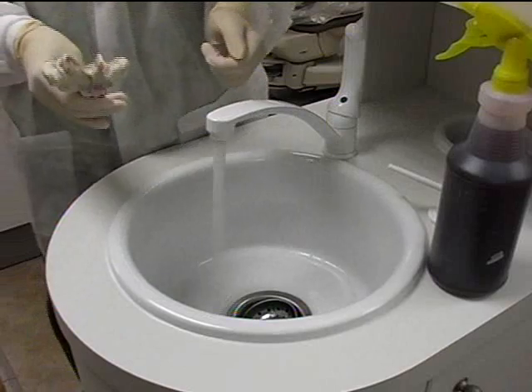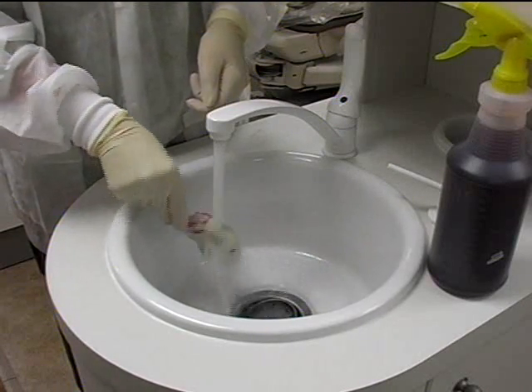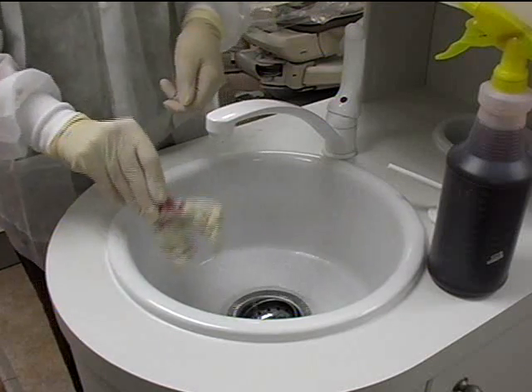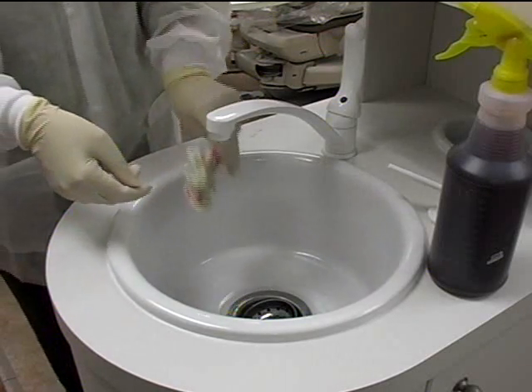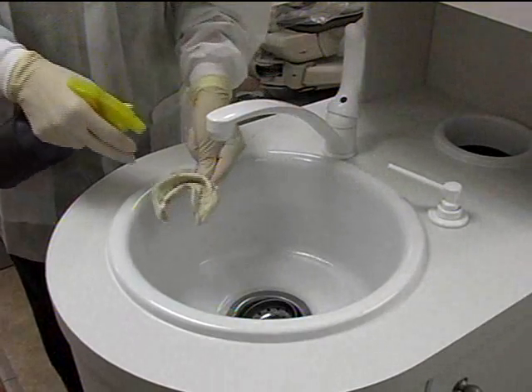Rinse the impression under tap water to remove saliva, and spray with a disinfectant.